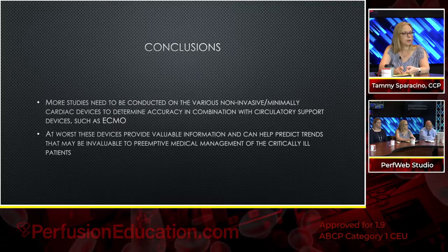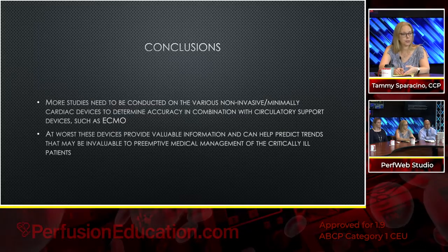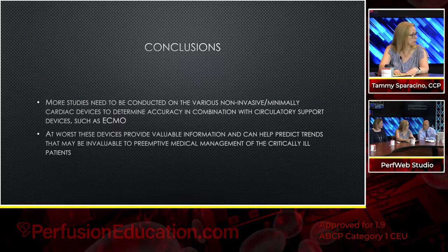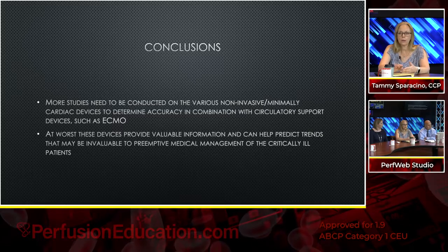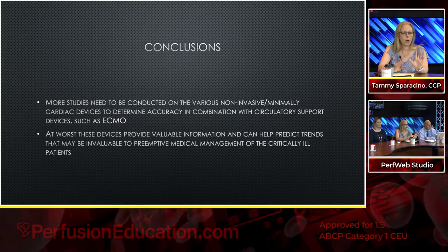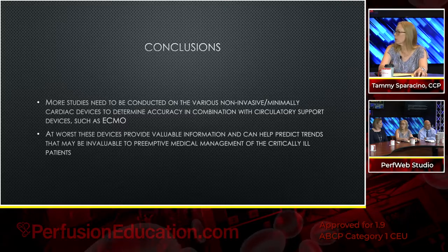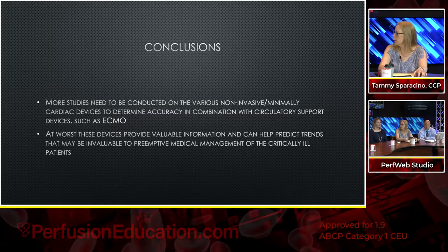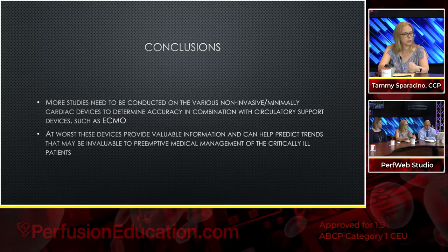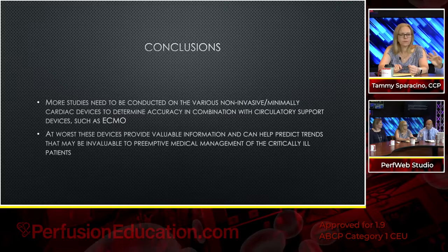This could really be preemptive to helping perfusionists in particular, and nurse ECMO specialists, as we start having those more and more, in trying to look at the patient and see one more piece of information before making determinations. Do we need more volume? Do we need more flow? Those kinds of things.